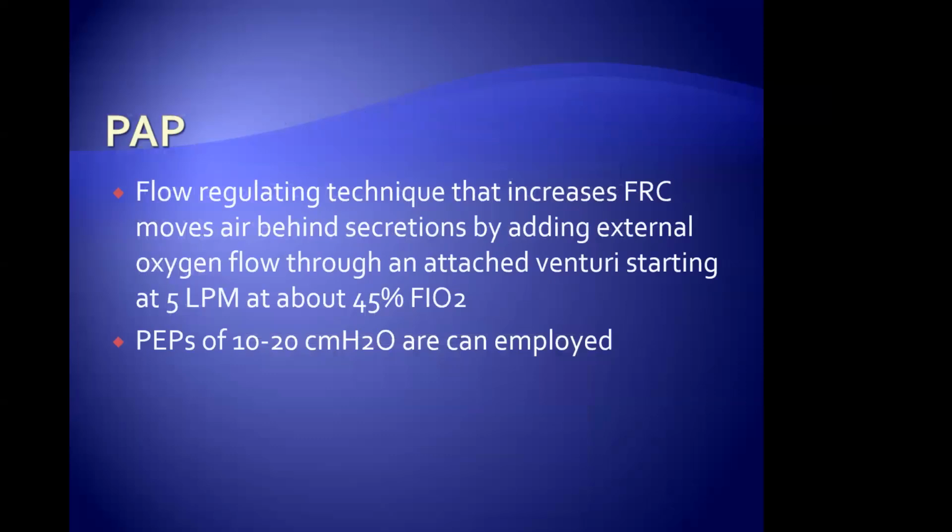PAP therapy, positive airway pressure. What does that do? It's a flow regulating technique that increases, again, here it is, FRC, and moves air behind secretions by adding external oxygen through an attached Venturi device starting at 5 liters, and it's a Venturi, so it's 45%. Those are huge tools, I think.